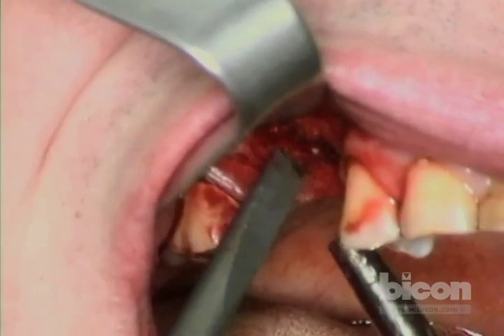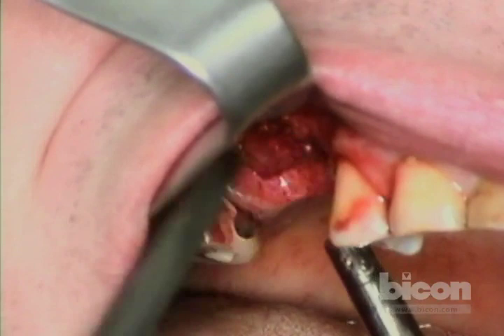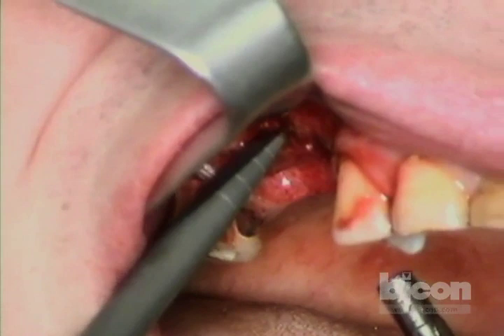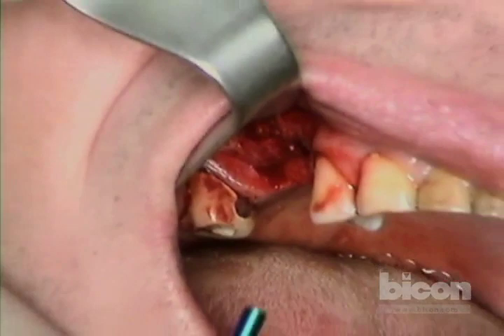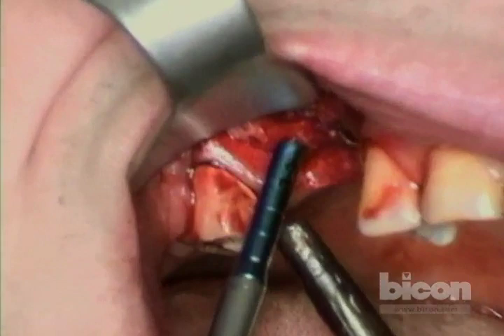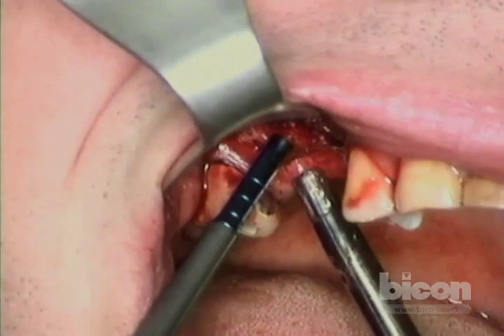Now that I've made all the cuts, I just need to make sure the anterior cut is re-established — this is the one coming against the anterior slope as seen on the X-ray. I'll go with a flat-top osteotome, which we normally use for sinus floor elevation — this is a three-millimeter one — aiming at the corners because those are the hardest to mobilize, and we start tapping.